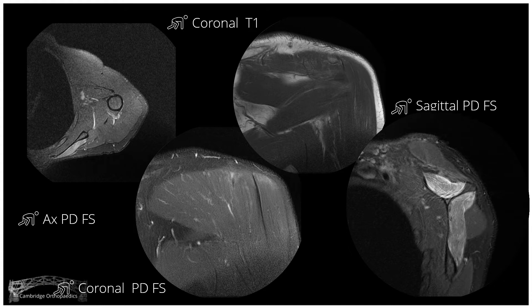Did you see the increased signal on the water images? The proton density fat-saturated images, the T2 images — the edema within supraspinatus and infraspinatus, suggesting acute denervation of supraspinatus and infraspinatus; in other words, an acute injury to the suprascapular nerve. Did you see the anatomy was normal on the coronal T1s with no cuff tears? Acute denervation of supraspinatus and infraspinatus due to a suprascapular nerve injury.